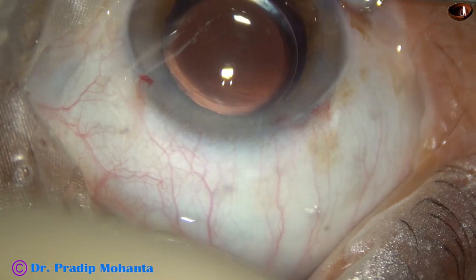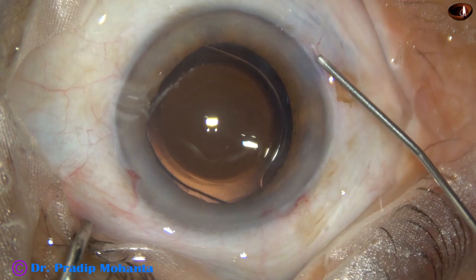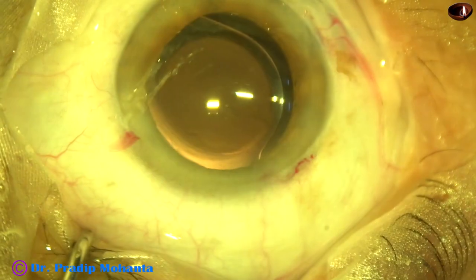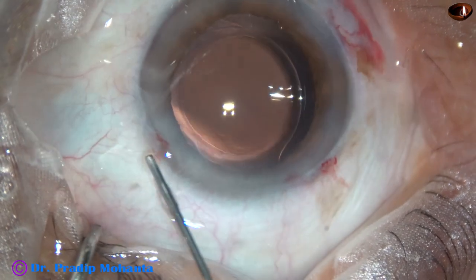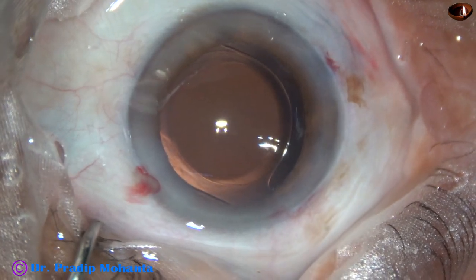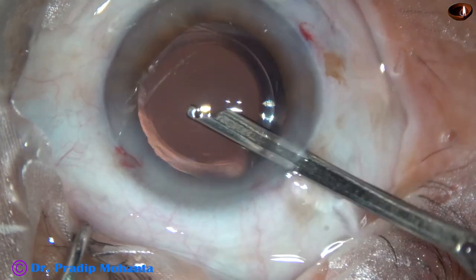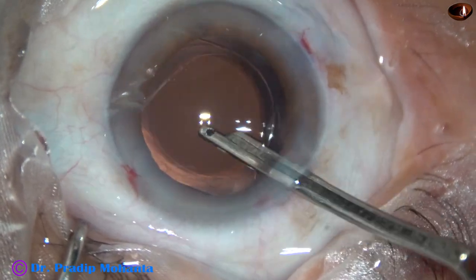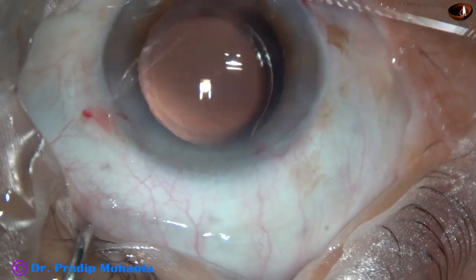We are towards the end of the surgery. This is a bit of moxifloxacin, and now the side ports are closed by hydrating corneal stroma on either side of the stab wounds. We can make out that the patient is under topical anesthesia. If we just hydrate the corneal stroma, the side ports get closed. This is the final lavage of the anterior chamber — whatever viscoelastic sticks to the corneal endothelium is removed at this time. The anterior chamber is formed very nicely and the case is concluded.